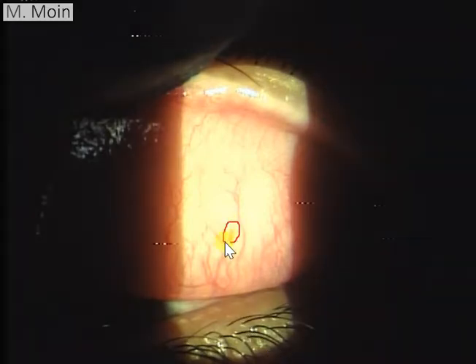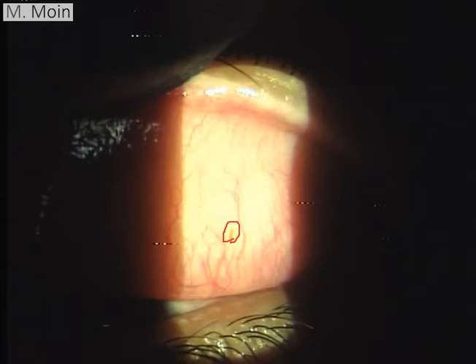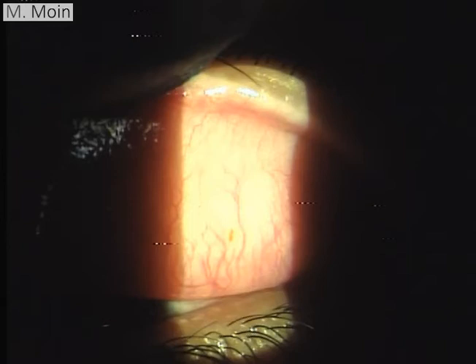This is a small foreign body which you can see. How can you remove that foreign body? One option is just to use a cotton bud, or the second option is to use a needle to remove that foreign body.